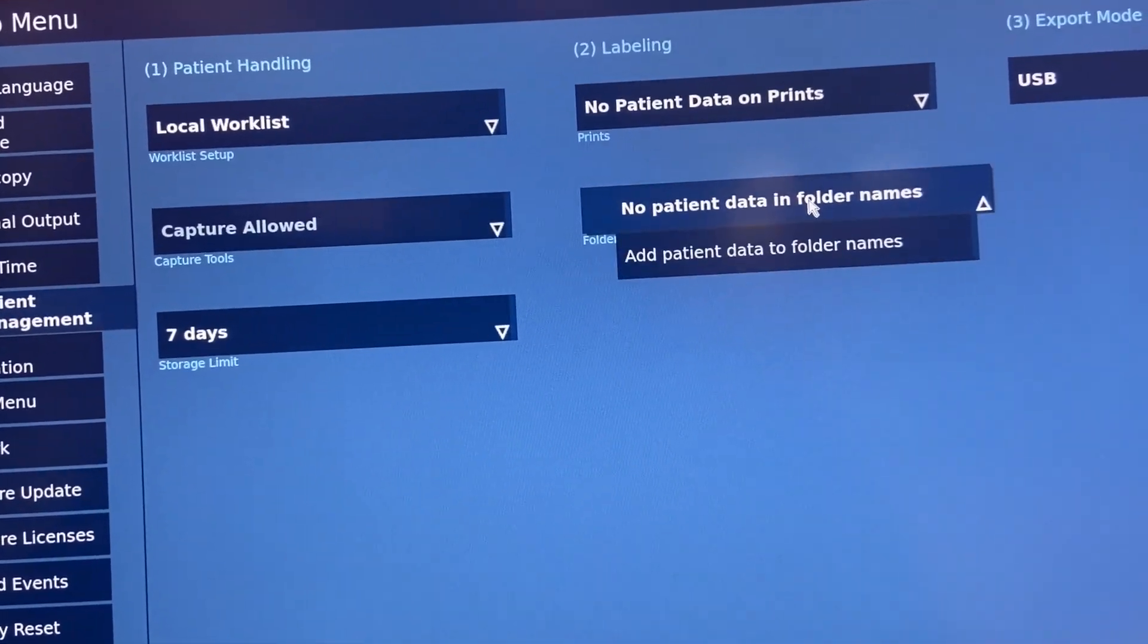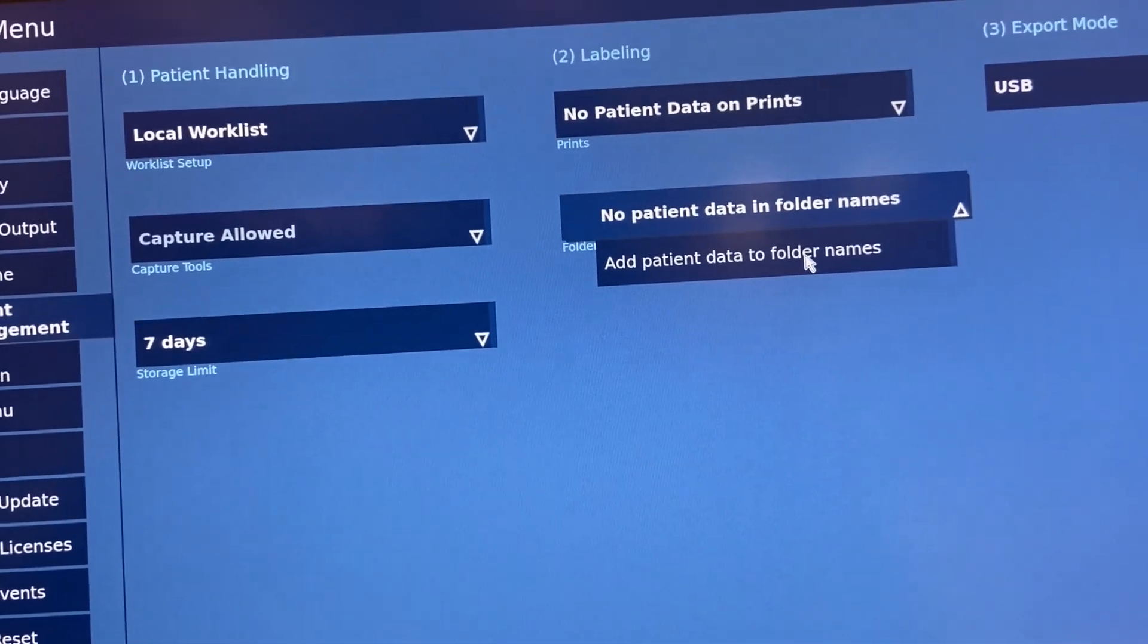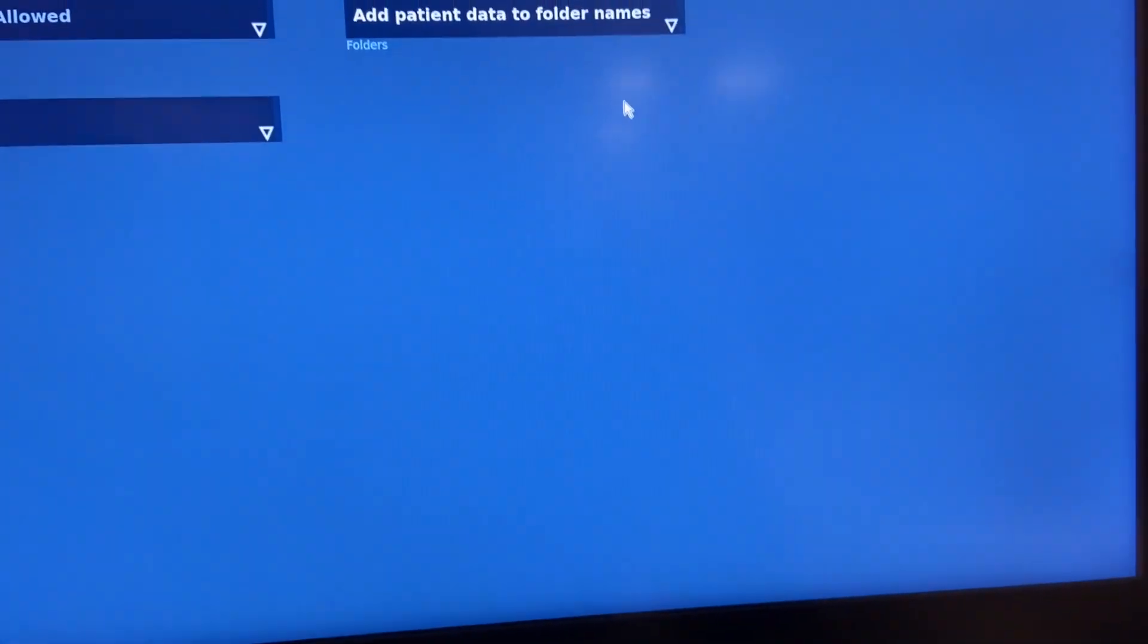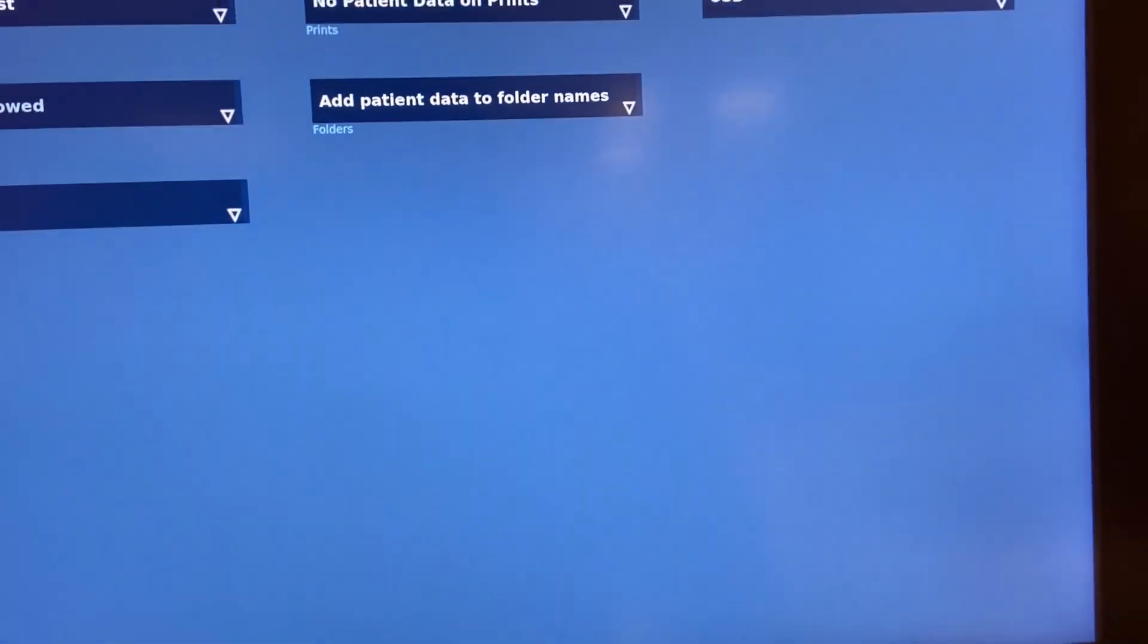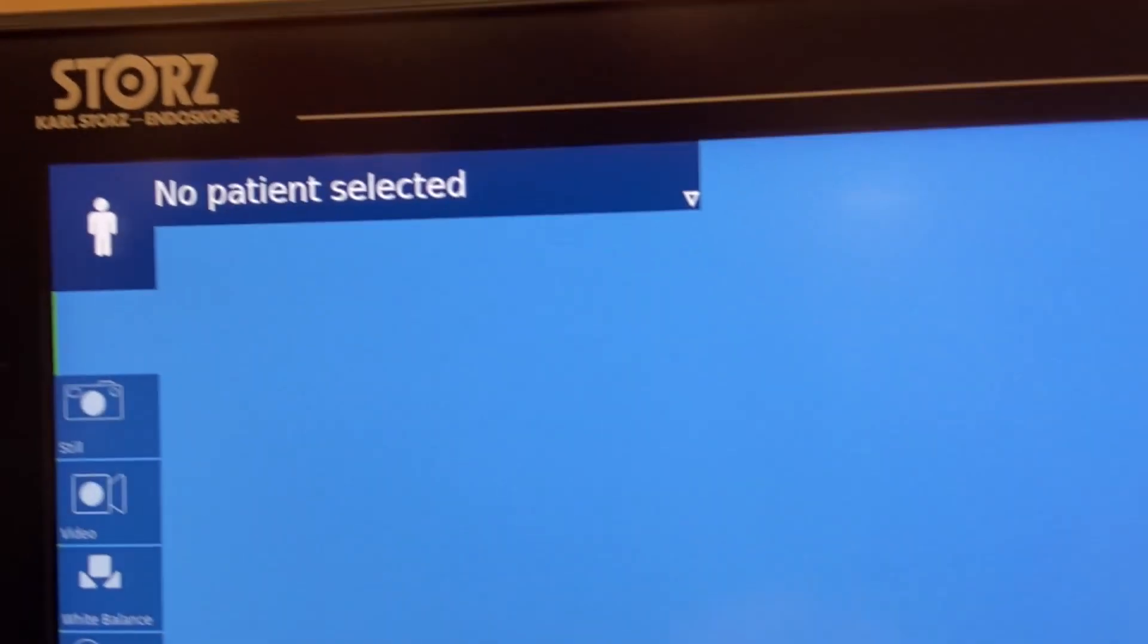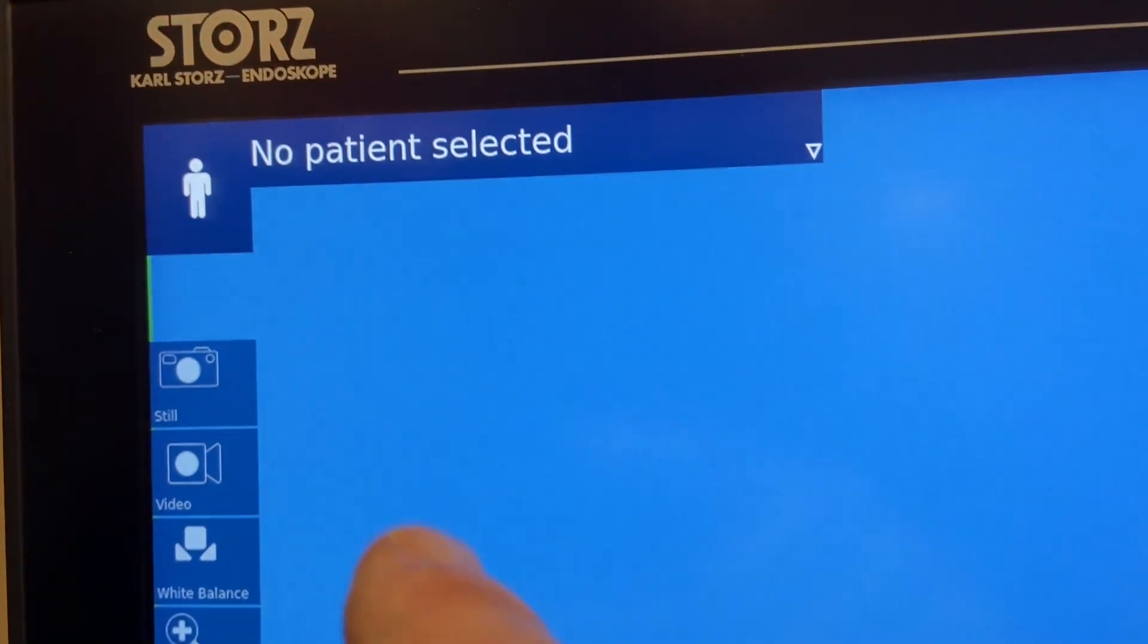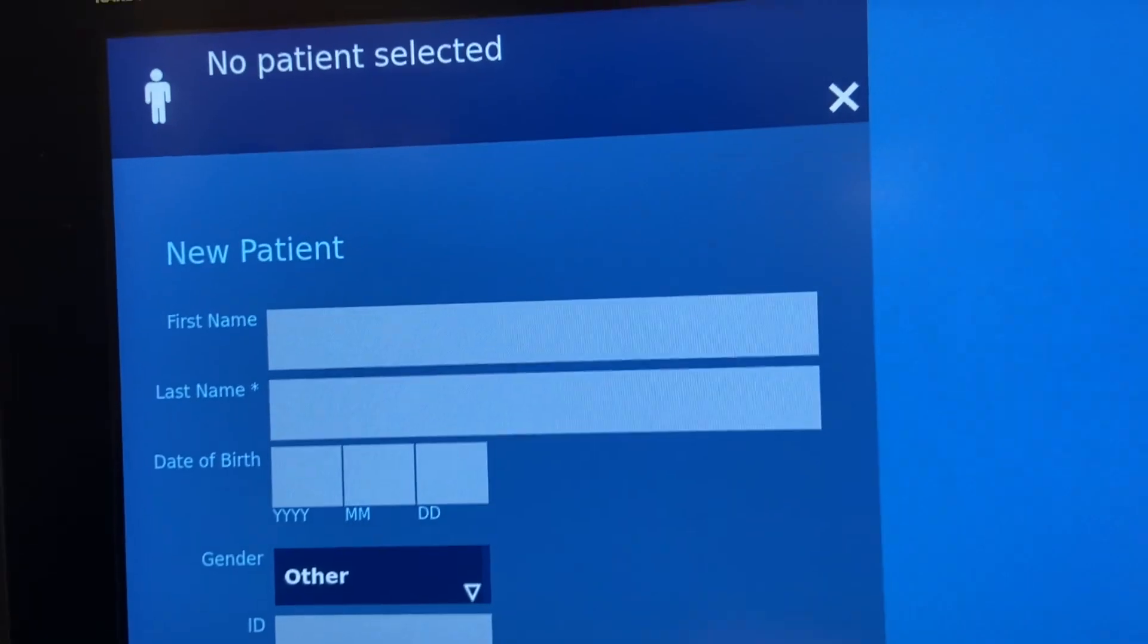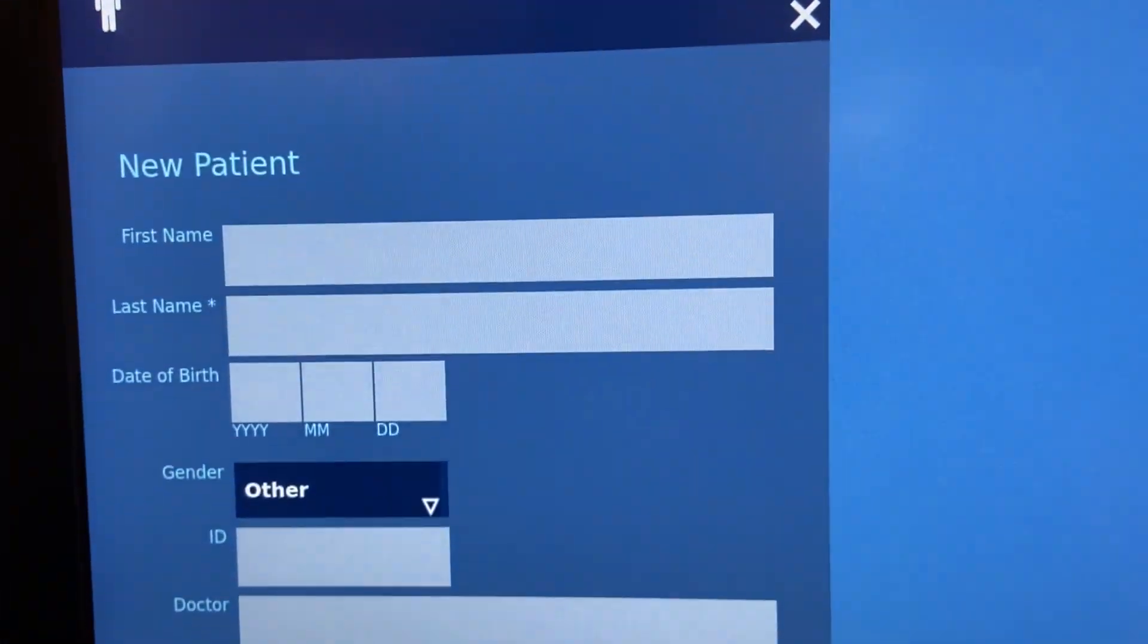Patient data on folder names and leave this at USB. Now you'll have this patient space up here where you can touch it and add your patient info.